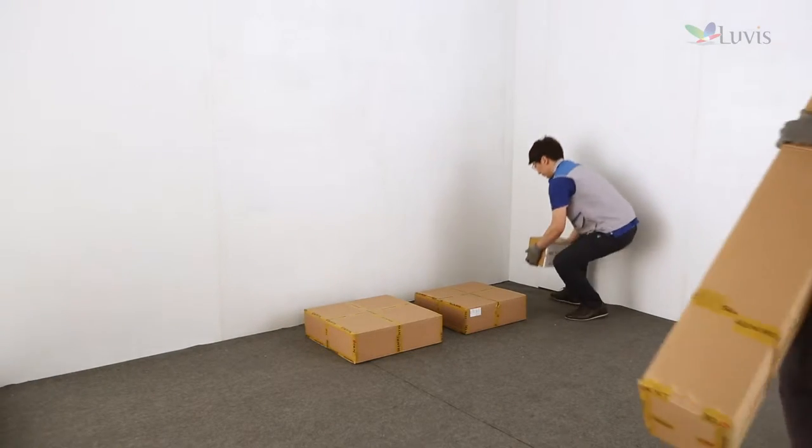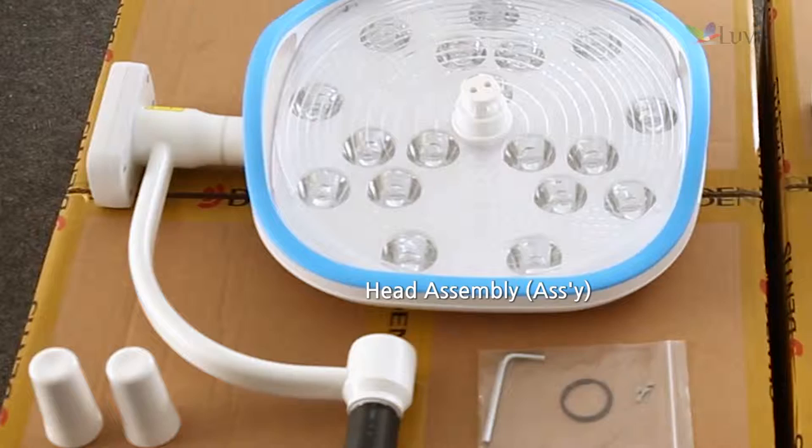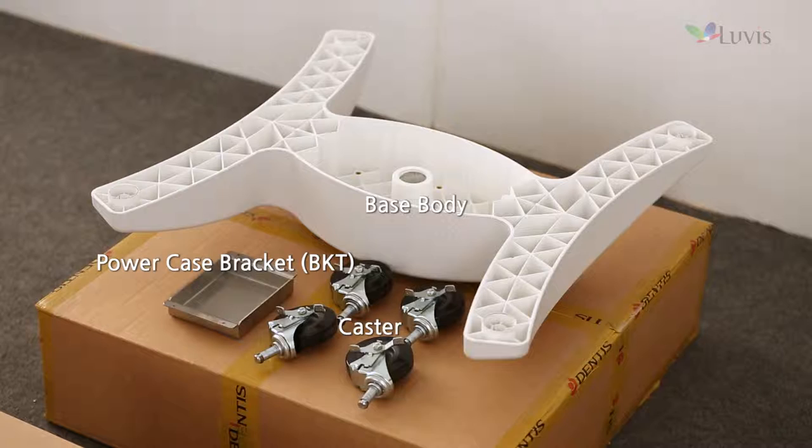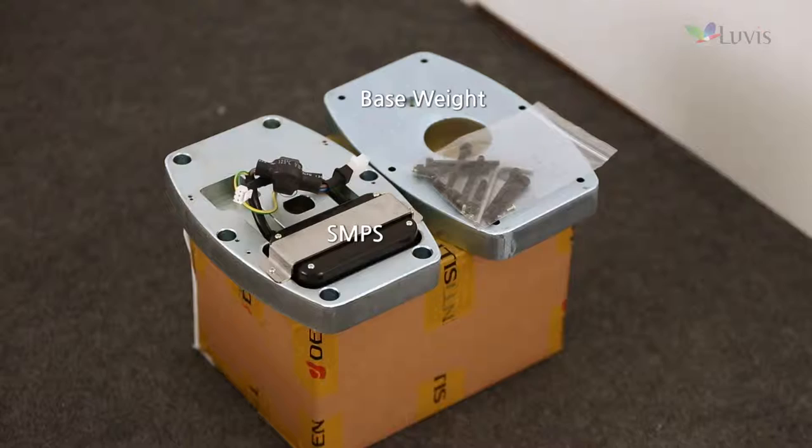Check components after opening the package box. Confirm the head assembly box, first horizontal and vertical arm box, base body and caster box, base weight and SMPS box.